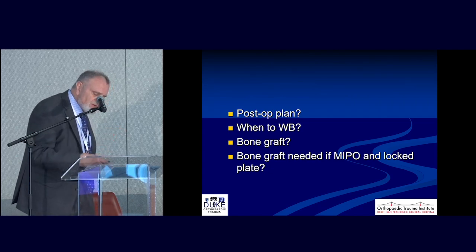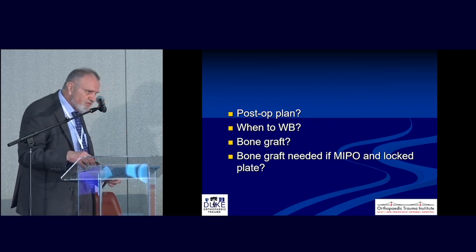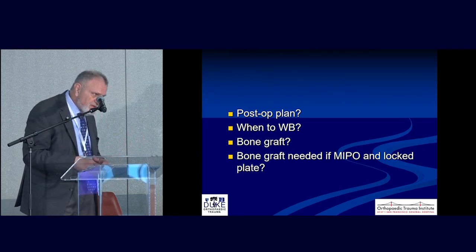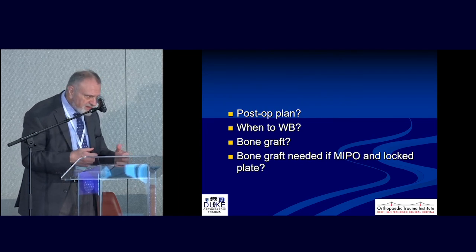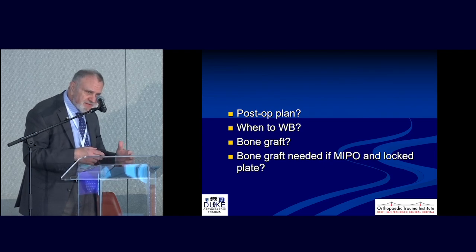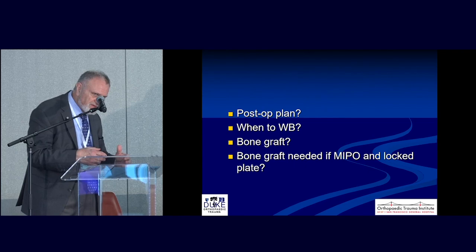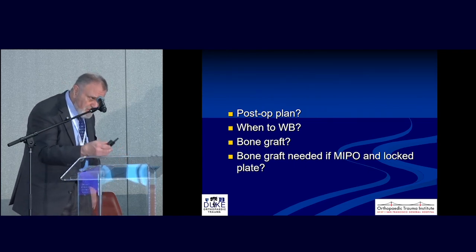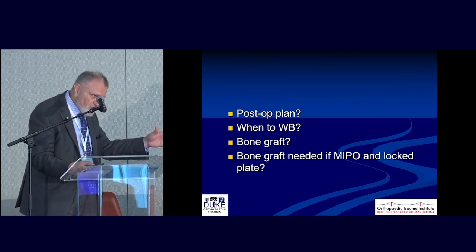No. So the reason I ask is particularly the early titanium LISS plates are super flexible. I trained with Mike Chapman like Tim, and Mike always talked about assessing your stability when you're done with your operation, and we would do that. But I remember the first time I used a LISS plate, you could just move that thing around because titanium's so relatively flexible compared to stainless. So I would do a stability test, understanding I have a LISS plate. It might be a little bit more than usual.